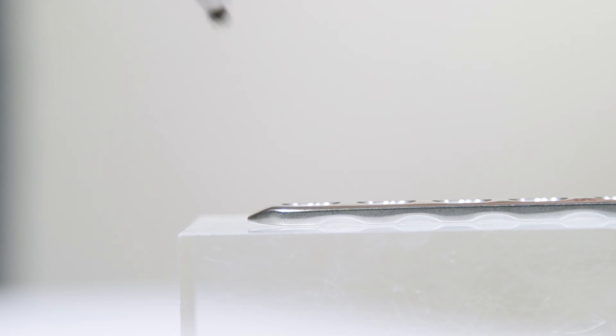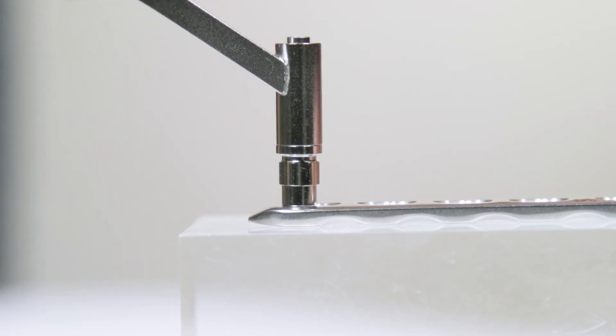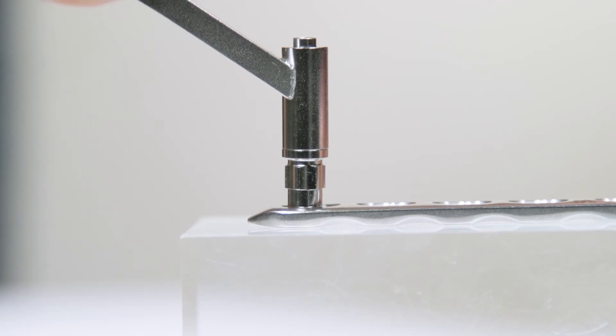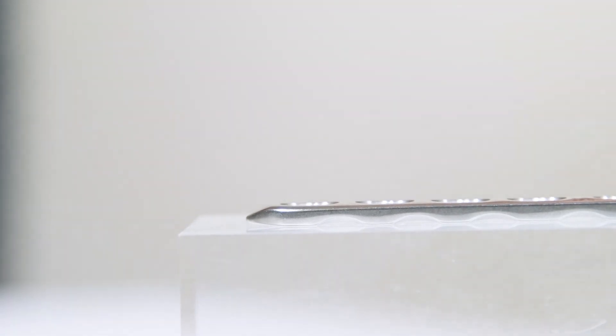To achieve neutral positioning of the pilot hole, the device is placed into the plate hole and pressure is applied to the spring-loaded tip. This achieves central positioning for the pilot hole.